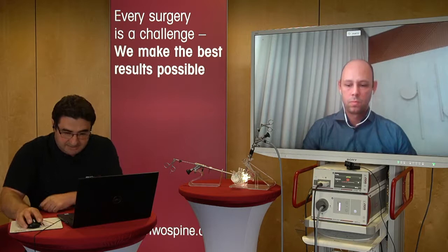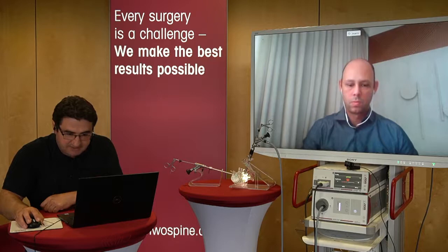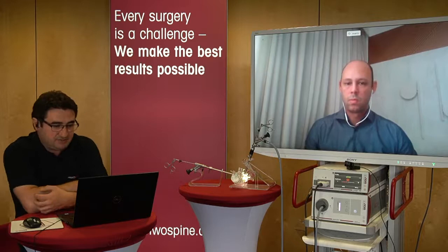What are the chances of cervical cord neurological deficit after posterior foraminotomy of the cervical spine? Did you have any experience with neural cord injury during endoscopic surgery? No, I never had neurological deficits in my cases. I have maybe 25 cases with the cervical approach, and I never used monitoring in my surgeries either. It's not necessary because I don't go to the medial part of the cord.